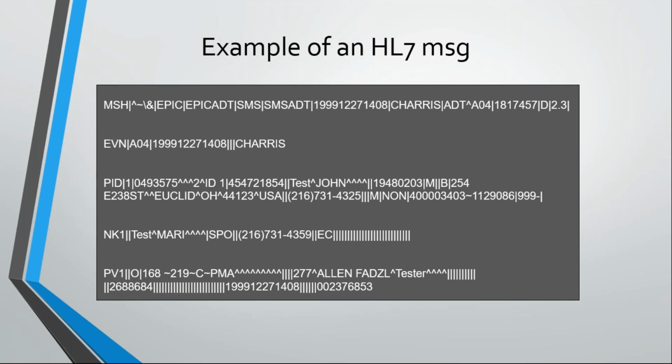Now, when we looked at the example of the rack, we said that we have a name for each rack. The first rack is for clothes, the second rack is for books, the third one is for something else, and so on. In a similar way, each and every HL7 segment will have its own name. If you observe the beginning of each segment, it has a name: MSH, EVN, PID, and they are nothing but acronyms.